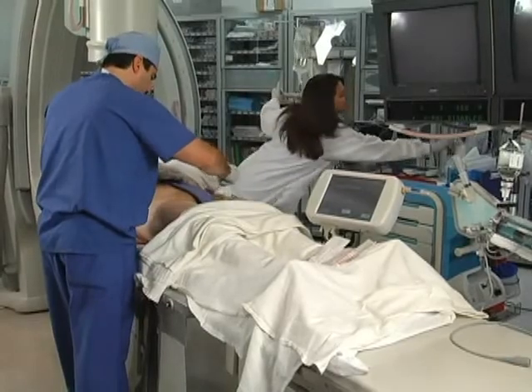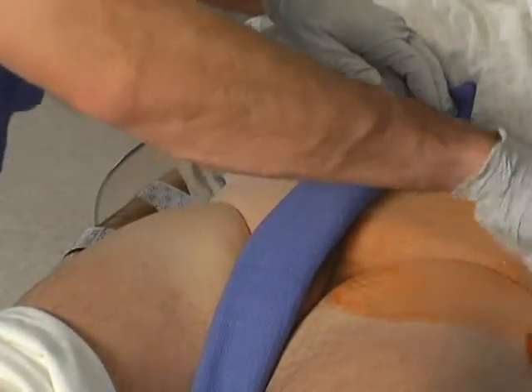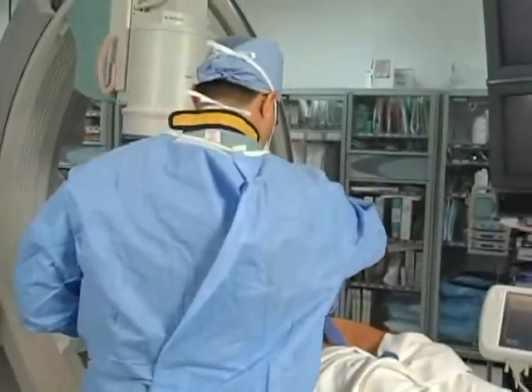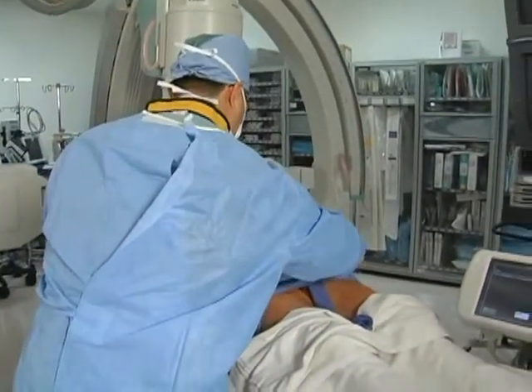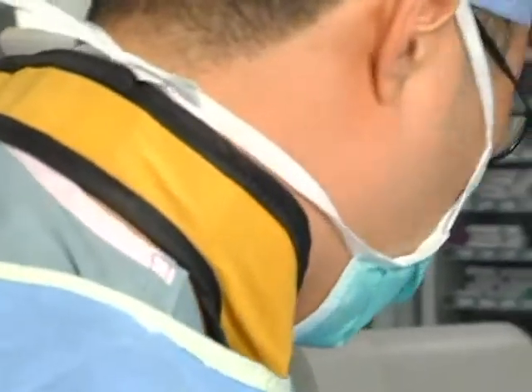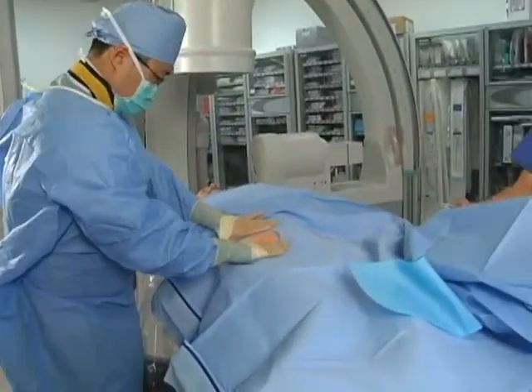The patient's hair is clipped. Chloroprep solution is then applied to both groins, and finally draping occurs shortly thereafter. Sterile technique is used for applying the chloroprep on both sides, and the drapes are then applied by the sterile scrub tech. The sterile drapes have two holes cut in them which are positioned directly over both femoral arteries. These holes permit access to the skin with minimal exposure of any other area, and assistants drape the entire table so that no area of the operating field is non-sterile. It is important to position the holes over the femoral artery and vein by palpation and slight adjustment.